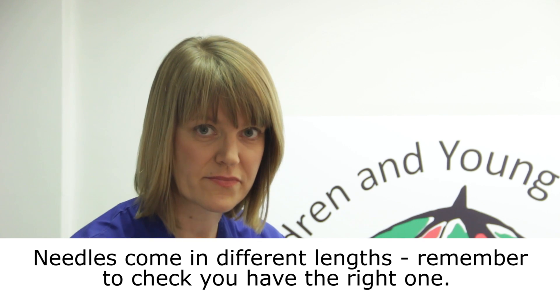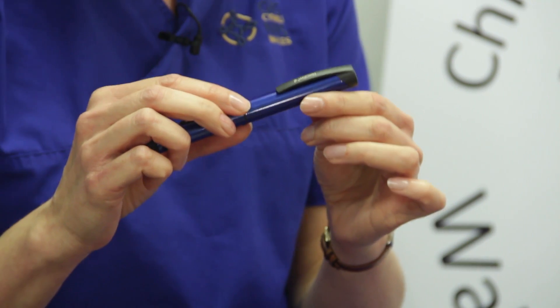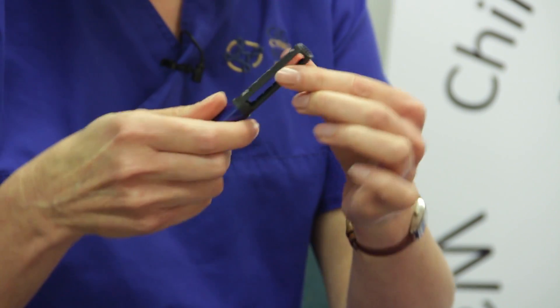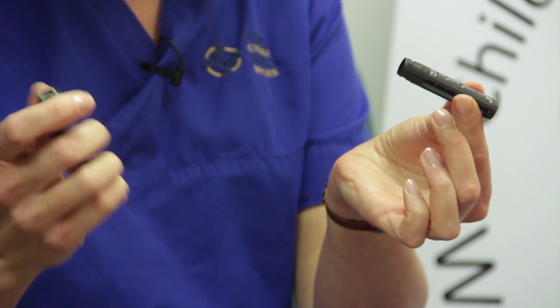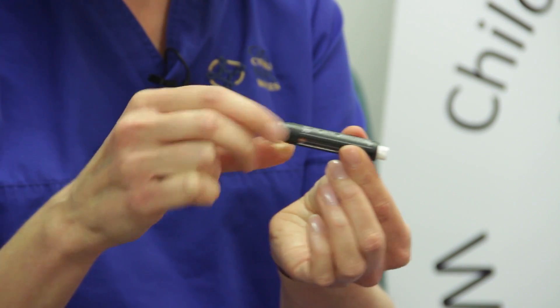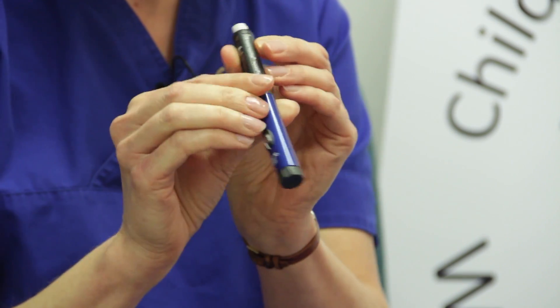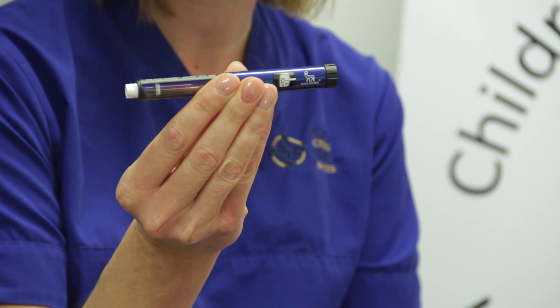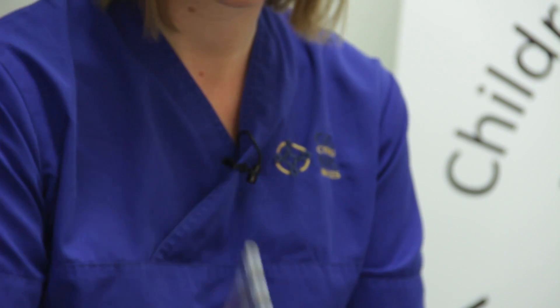The insulin cartridge will usually be loaded into the pen, but if you need to change the insulin cartridge, this is how you do it. First, you remove the lid from the pen, then you unscrew the pen in the middle. You take out the old insulin cartridge, put the new one in, and then connect the two halves back together again.